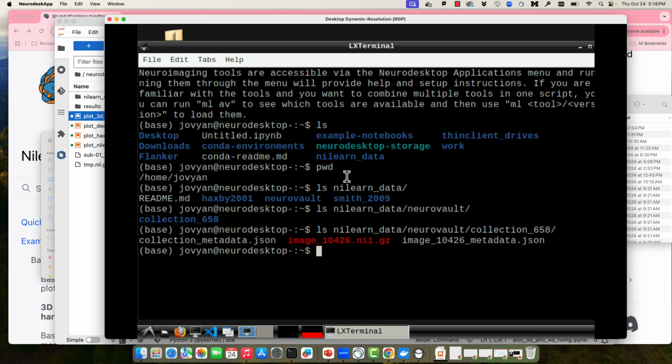So this next Jupyter Notebook, we're going to run it very quickly because I want to show you how you can manipulate images within Jupyter Notebook, and then how you can then use it outside of that if, for example, you prefer to visualize it in FSLeyes, AFNI, whatever you want. And then we'll get to the machine learning.